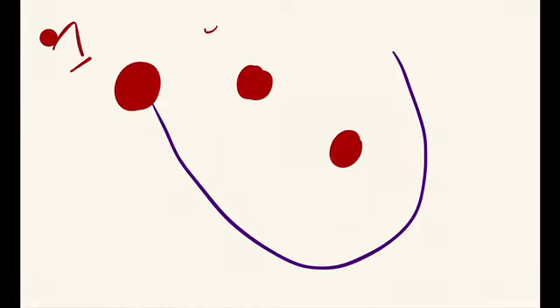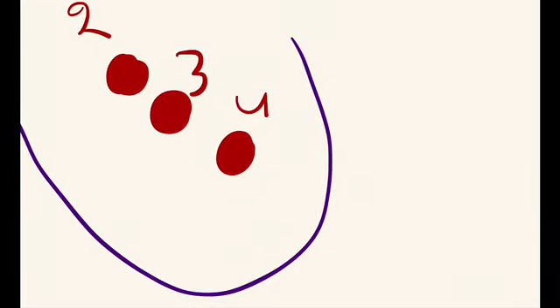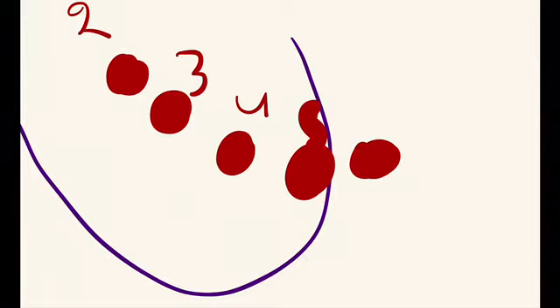Lead V1, V2, V3, V4, and V5 and V6. Look at it in a three-dimensional way. This is V5 and V6.